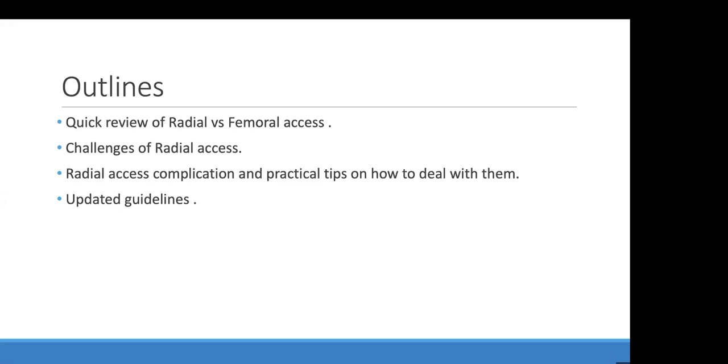radial skills, and it's a different set of skills, but also you have to be safe with femoral, meaning that you know how to do a safe femoral puncture for different variety, either because you failed radial access or for large bore intervention. When we do Impella, we need a large bore for inserting our equipment, and also for TAVI and structural procedures, you need femoral access. So the review today is just an outline about what we'll talk about: radial versus femoral access, the technique, and also the best is to learn it by doing.